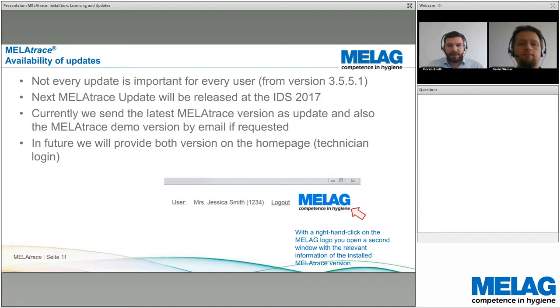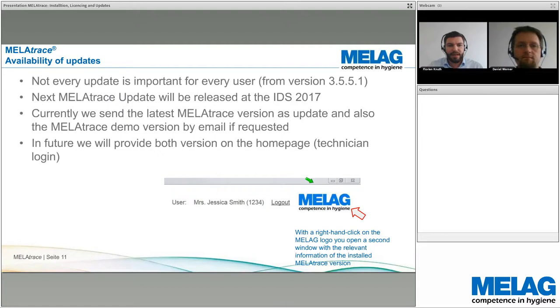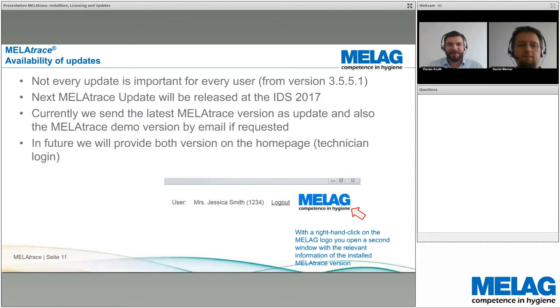To check which version is installed: start MelaTrace and right-click on the Mela logo in the right corner. There you'll find all the relevant information — the currently installed version, the serial number, and so on.